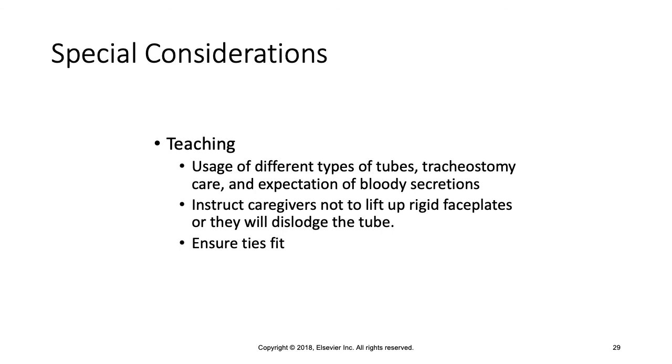Teach your patients that there are different types of tubes. Teach them about the particular tube that they have. If they have a cuffed tube, what that means. If they have a fenestrated tube, or a speaking valve in place, they'll receive special instructions as well. Teach how to care for that tracheostomy tube, making sure that it stays secure because it is their airway, the way that they receive oxygen.